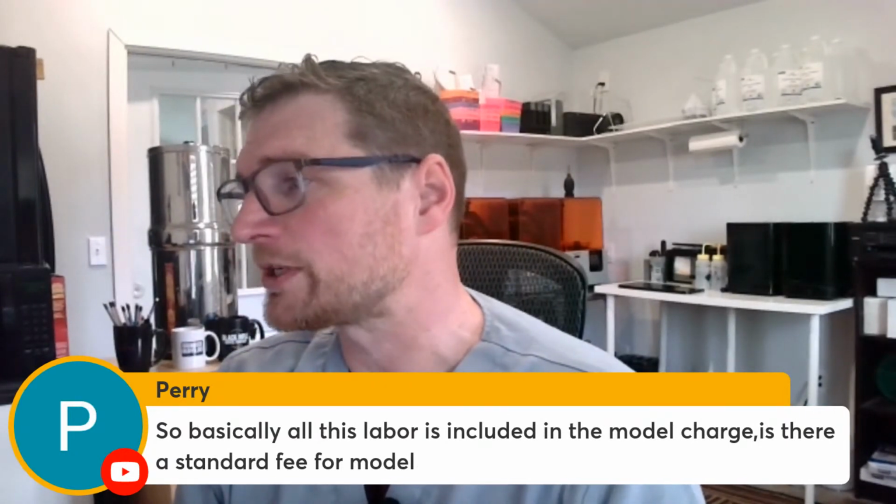It's gotten more expensive. Digital is cool and stuff, but cheap is analog, a plaster model. Taking impressions, 11 cents, and maybe another 50 cents in stone to pour it up. It's cheap, but you only have one copy of that, and if someone loses their retainer, you've got to take a new impression, because most likely that model got destroyed when you made the retainer. So you've got to take a new impression.